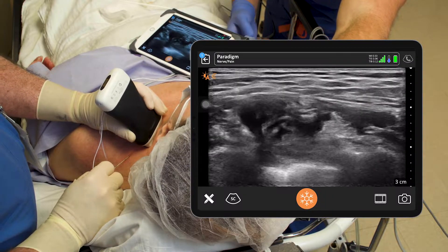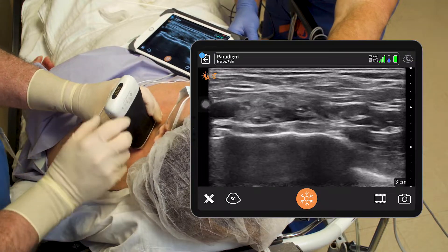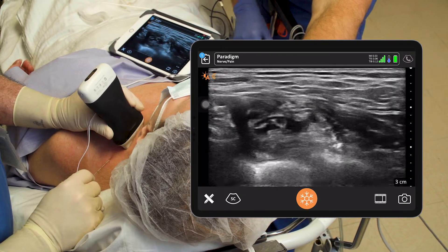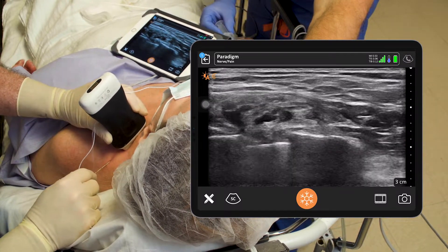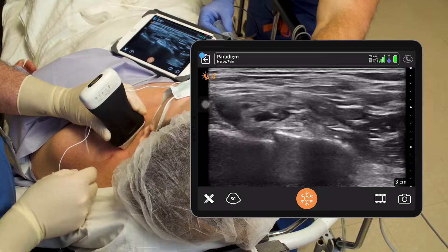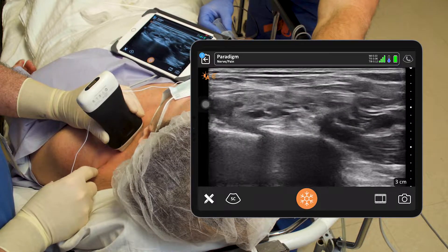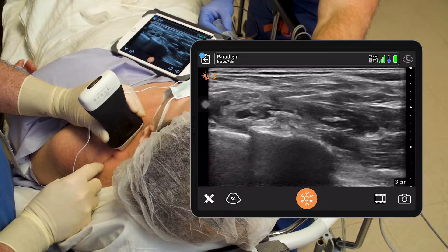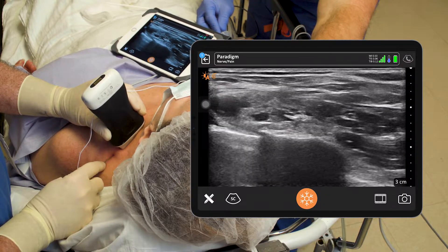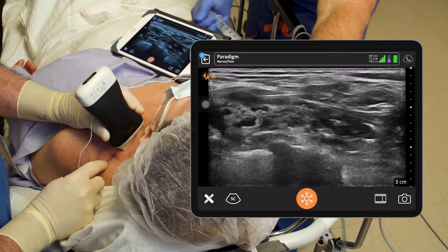Now we'll try to get up here and get this upper trunk a little bit. Sometimes if the upper trunk is open you can get right under it pretty easily, but if it's really packed in tight like this, sometimes I'll just scan up the neck and I can see it a little better here. We really need the middle and lower trunk, so it's not that big a deal on this case, but actually I'll just come over the top here — give me five right here and we'll get the upper trunk real easy.